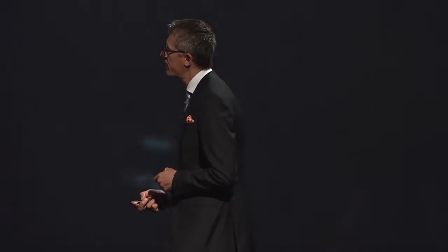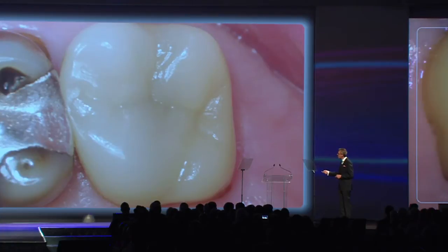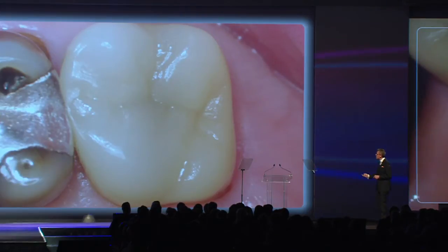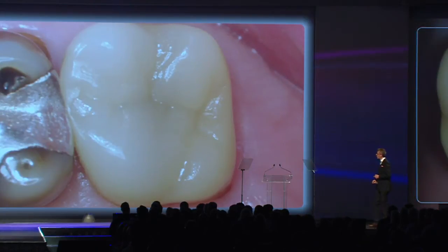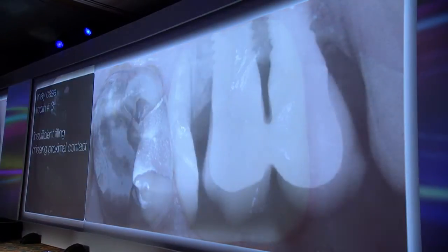Another view, and this is after a healing period of 1 to 2 weeks. And a closer look, and I made a small video to see the restoration. You see the palatal side, very nice healing of the gingiva at the distal after this gingivectomy. So the final result of this case done with the OmniCam camera.